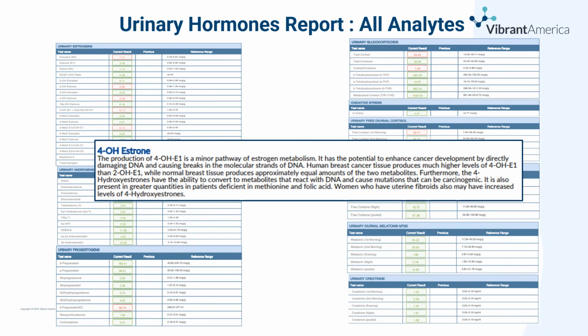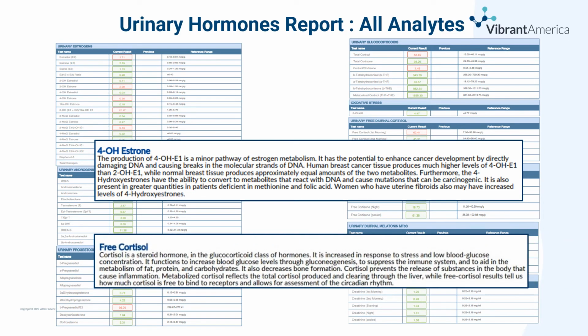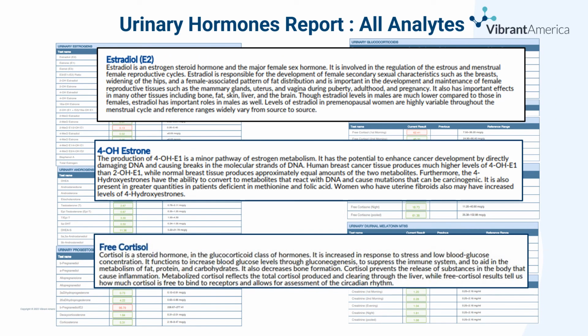Before we move on, here are some of the report comments that you will see on your report. They will be in the corresponding section at the end of the section to aid you in interpretation of any of the analytes that are out of the reference range.